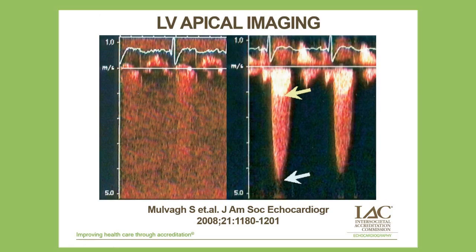Similarly, for the Doppler echocardiography findings of left-sided disease, for example aortic stenosis or picking up pulmonary venous signals, it is often helpful to use contrast as well. This is an example of a patient that had very difficult windows but had definite calcific changes on their aortic valve. And you can see during an infusion of contrast, a signal that was almost impossible to get without contrast was picked up very nicely by lowering the Doppler gain to about 10 to 20%, infusing the contrast to get rid of the noise, and picking up very nicely the aortic stenosis signal.